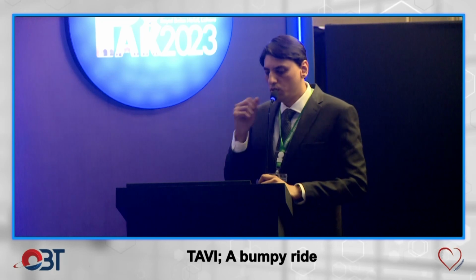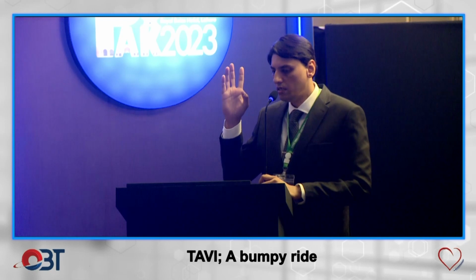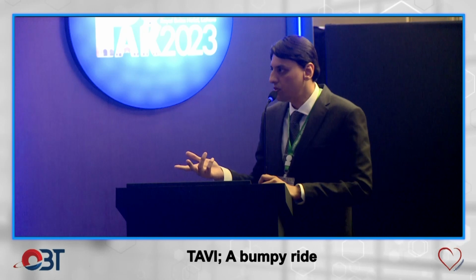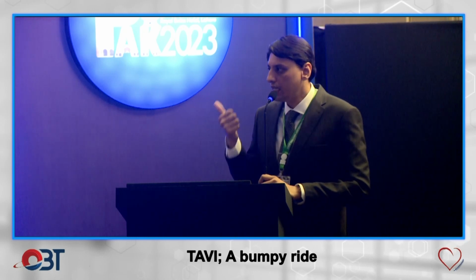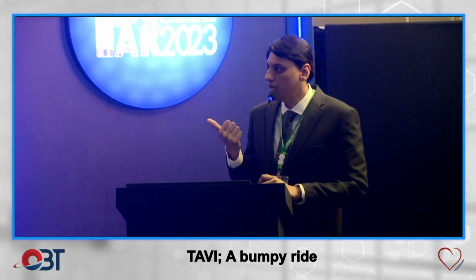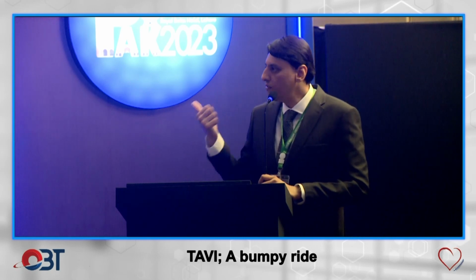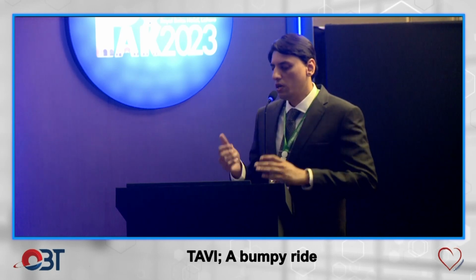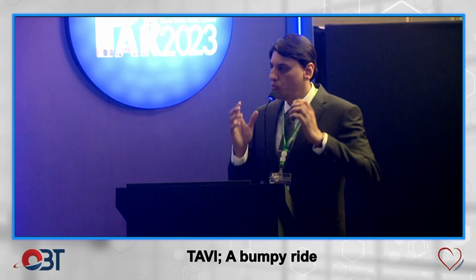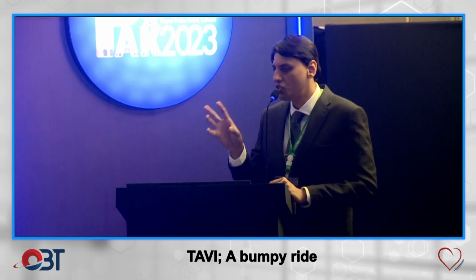Another important point that you have raised: you have to consider things like intercommissural distance, the length of the raphe, and the calcium that is involved. In my case, it was a heavily calcified valve with both the commissures and the raphe involved, and the raphe length was 14. So we might have undersized our valve, but we decided that we would go for an extra dilation.